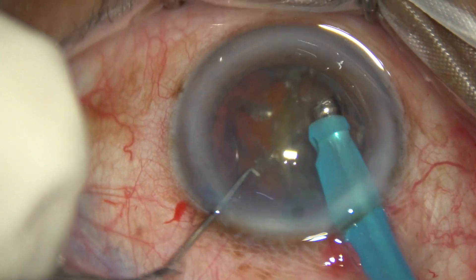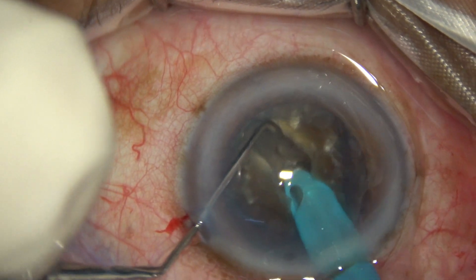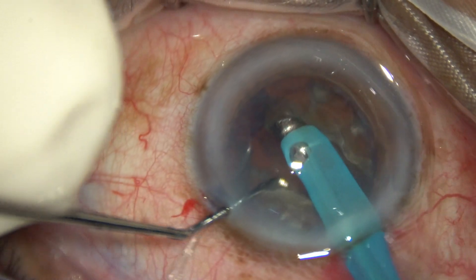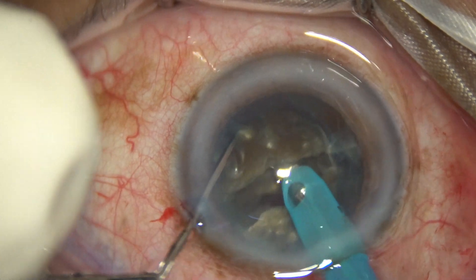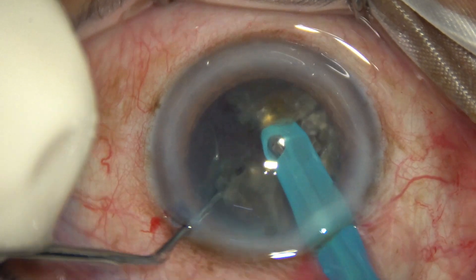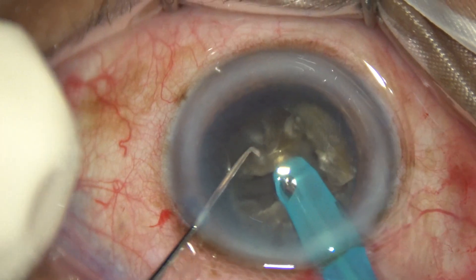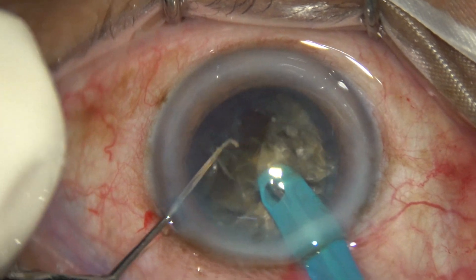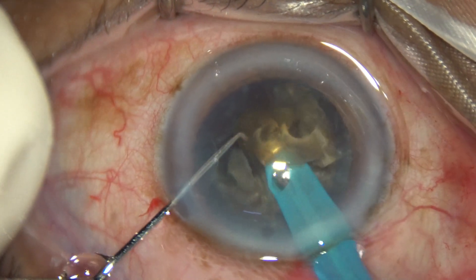I rotate the nucleus 180 degrees, sculpt the other side, and then hold the hemi-nucleus with vacuum. The chopper is used to separate the two hemi-nuclei. One hemi-nucleus is then divided into two, and then one fragment of the hemi-nucleus is subdivided into two smaller pieces. I start emulsifying these smaller pieces.